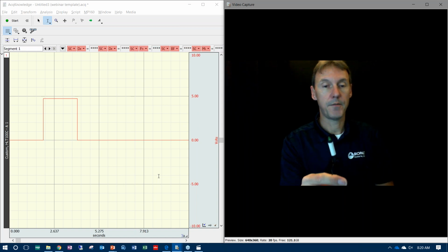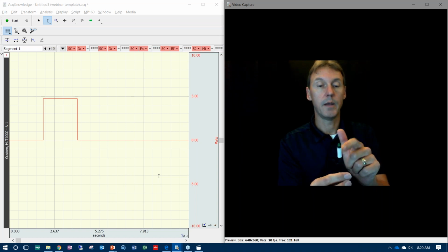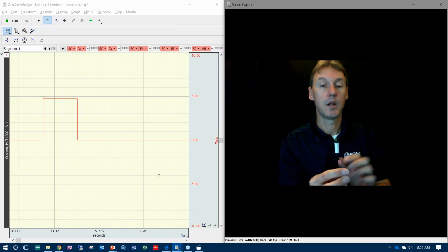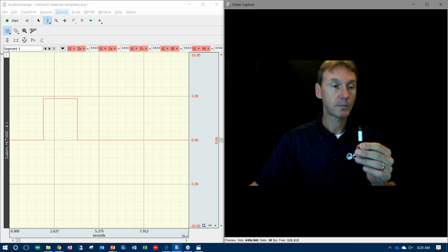Normally you have this in proximity to the participant. They don't need to be holding it like this. As long as the camera can pick the light coming on, that's all you need. And then when you go into the playback mode, it's very easy to align the stimulus, or the point where the power was sent to turn the light on, with the actual illumination of the LED in the video.